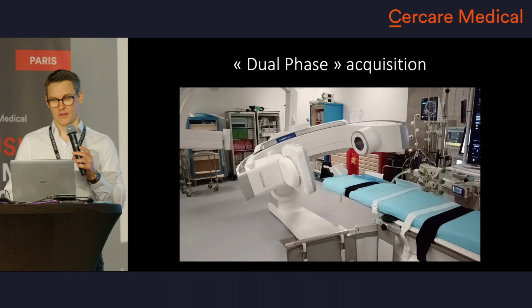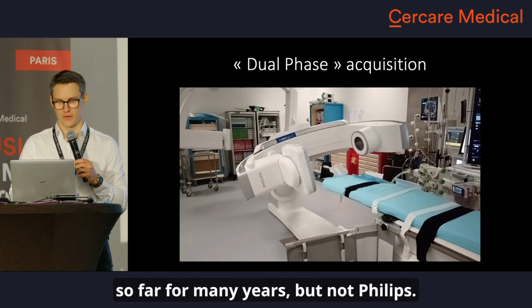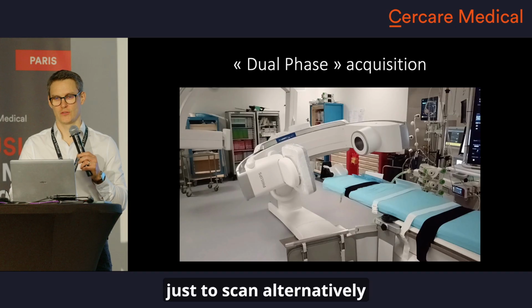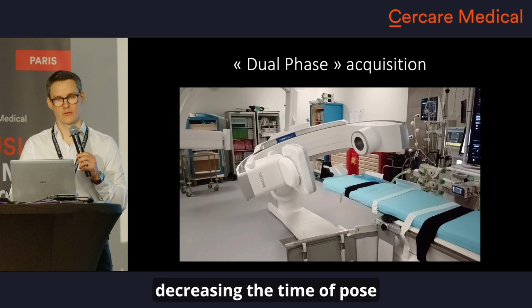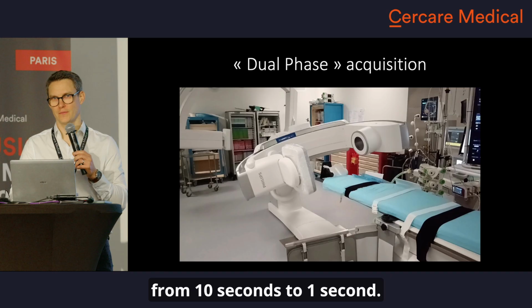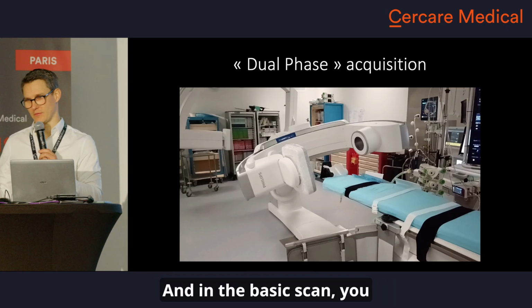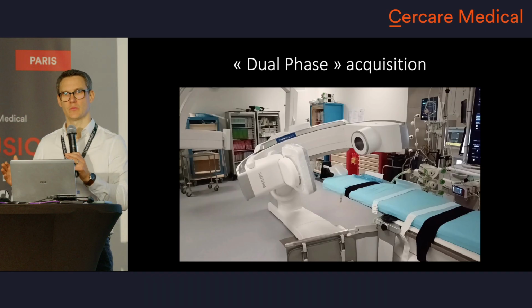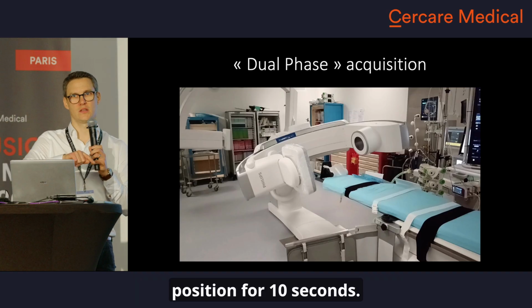What's interesting is this. Siemens has been capable of doing that for many years, but not Philips. Now they are capable of scanning alternately from the right to the left and the left to the right. So this is largely decreasing the pause time from 10 seconds to 1 second. In the basic scan, you got like 10 seconds acquisition plus 10 seconds pause, meaning you scan for 10 seconds, and it goes back to its position for 10 seconds.